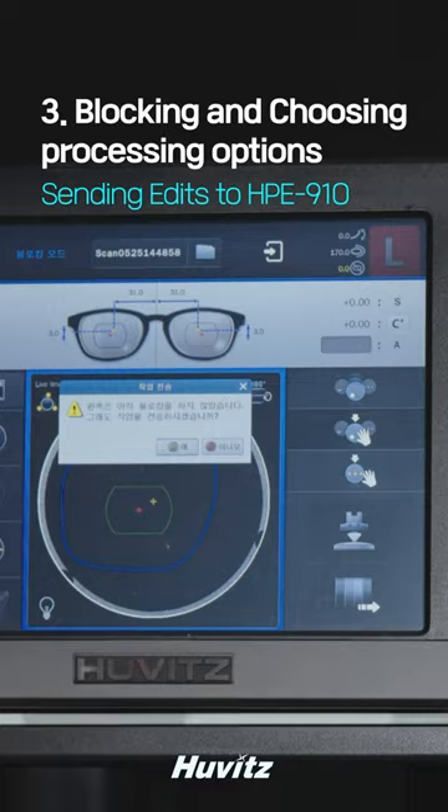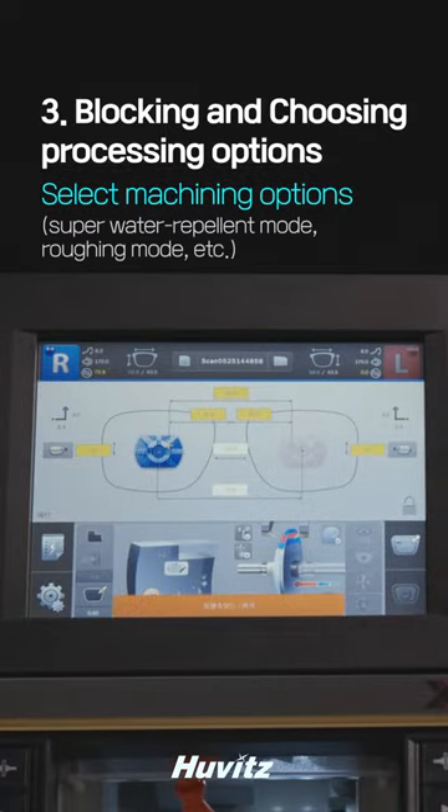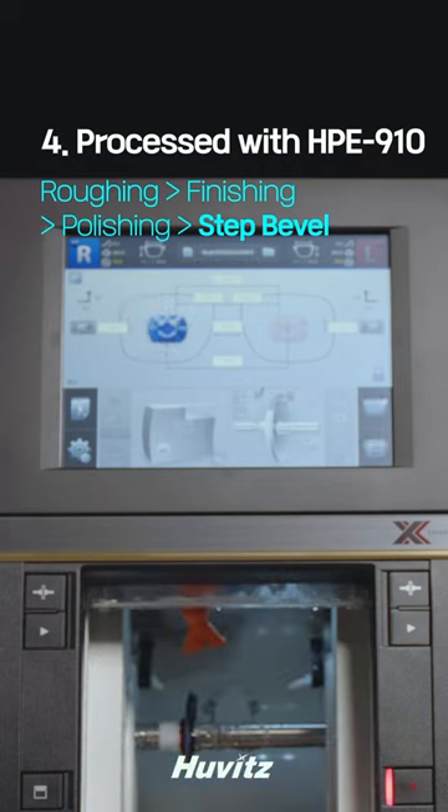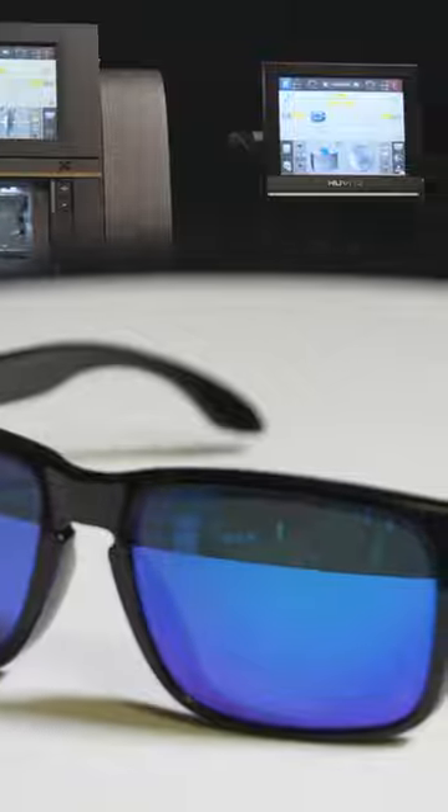After blocking, transfer the edit to the HPE-910 and select the processing option. It is processed in HPE-910 and it is done. Use a combination of Huvitz's Autoblocker and edger to create the perfect pair of Oakley's Holbrook frames.